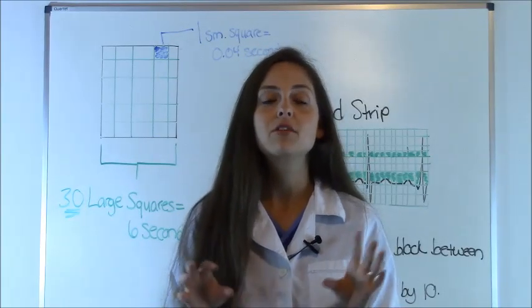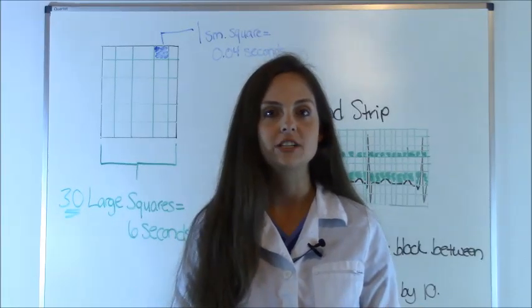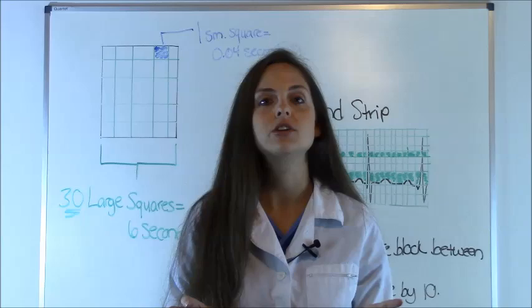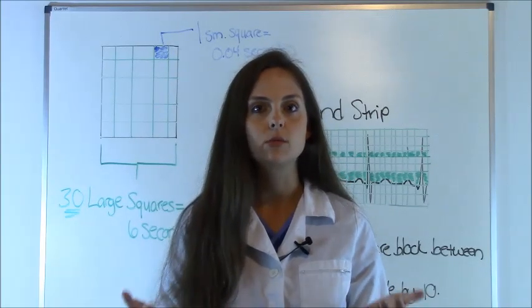But in this video, I'm going to give you a quick tutorial on how to use the 6 second rule in counting a heart rate on an EKG. There are various techniques you can use, but I find that the 6 second rule is the easiest, especially if your rhythm is irregular.